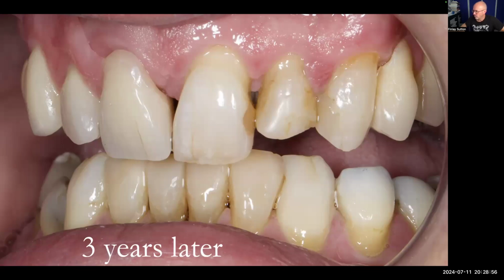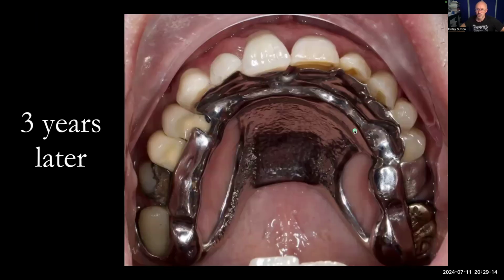So let's have a quick look at a question. Ambream asks, when we give a tooth made of cobalt chromium due to limited space, we decrease tooth contact to 1/3, but in this design, all the contacts are on the cobalt chrome framework. Absolutely. Yeah, so all of the bite, totally, Ambream, you're right. It's on the metalwork like that, just like this. So that's great.